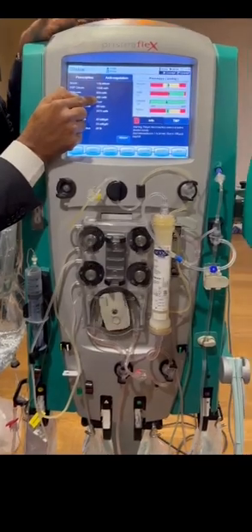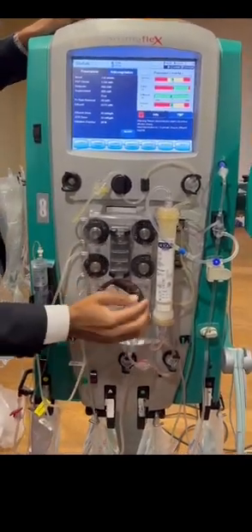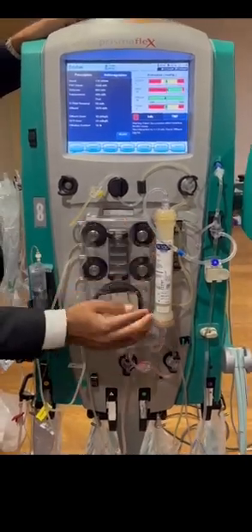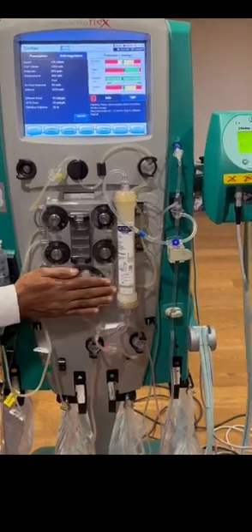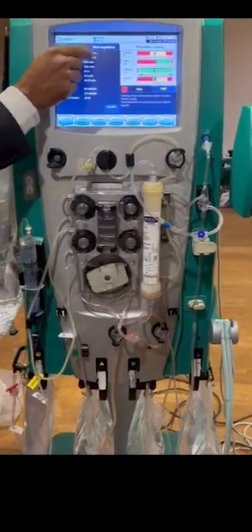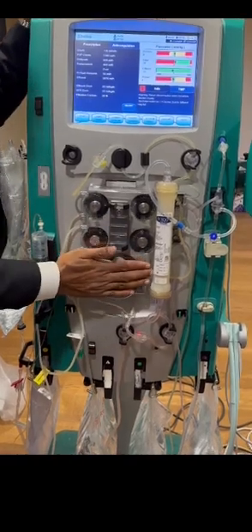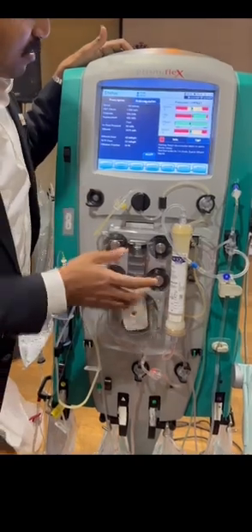How much is it? 1700. The blood pump should be the fastest because it is per minute. Among the four pumps, the blood pump is the highest speed, because blood pump is per minute. 130 ml per minute means in 60 minutes you have to calculate. The blood pump has the highest speed. Which one is next? Effluent.